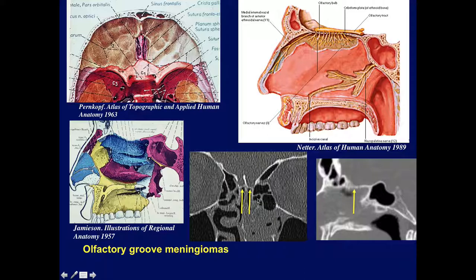On the coronal CT scan we see the crista galli and the region of the cribriform plate. On the sagittal CT, the cribriform plate appears indistinct because of all the olfactory nerve fibers crossing through. Behind it is the planum sphenoidale and the tuberculum sellae. On this diagram we see the olfactory tract and olfactory bulb, with all the olfactory fibers crossing through the cribriform plate.